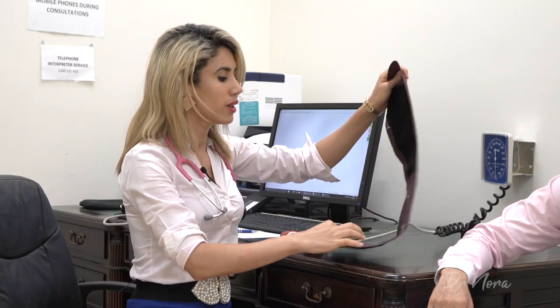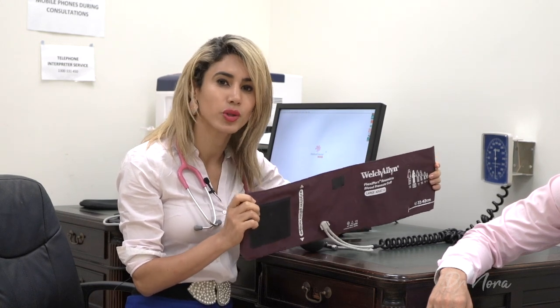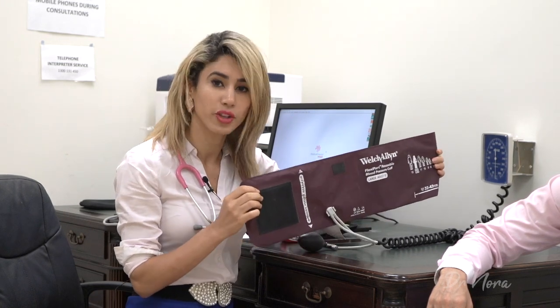Before we get started, it's really important to choose the correct cuff size for your patient. You don't want to go too small and you don't want to go too large, because this will give you an inaccurate reading. So make sure you're choosing the correct cuff size. For this patient, I'm using an adult size cuff.